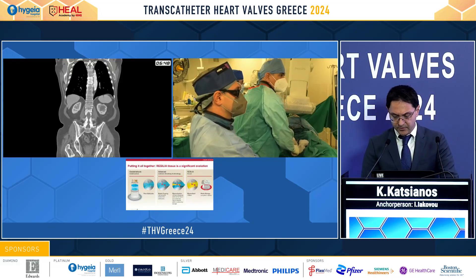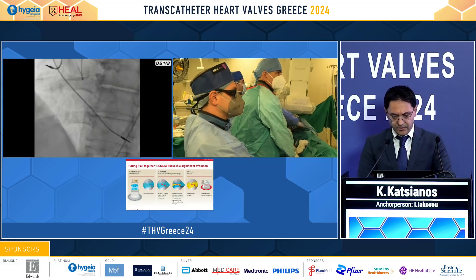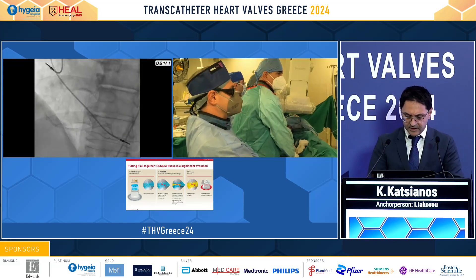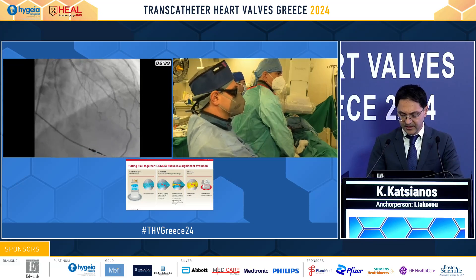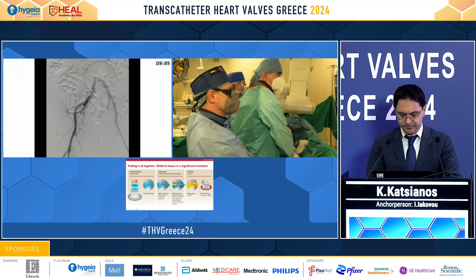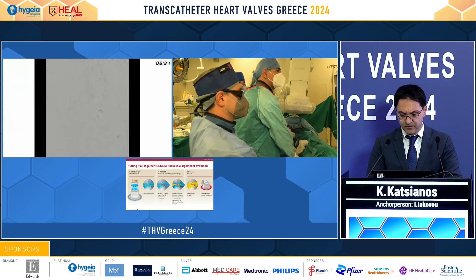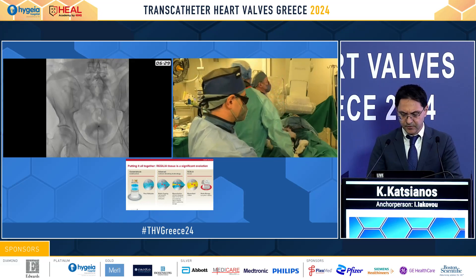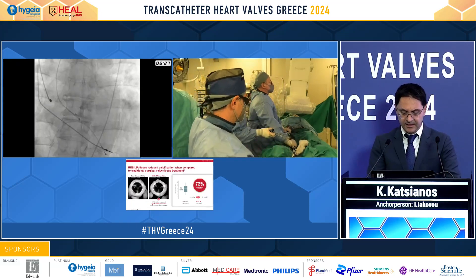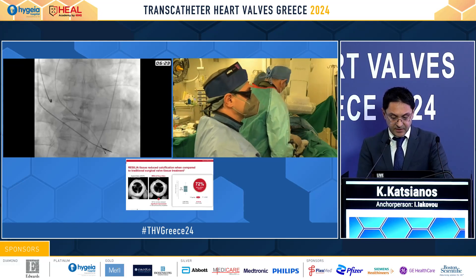Moving forward, the coronaries of the patient didn't show anything crucial. The peripheral axis was also feasible. We see the right side and the heavily calcified aortic valve.